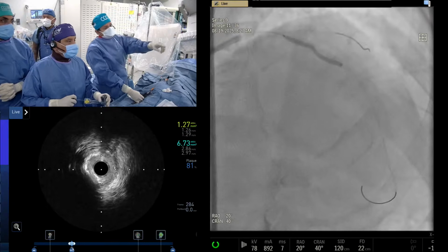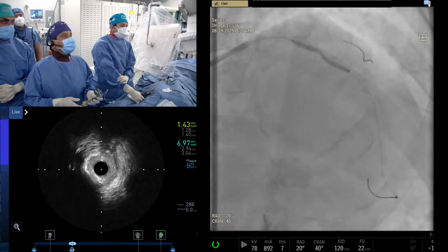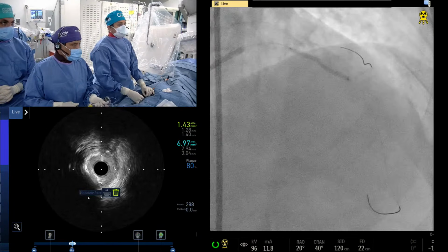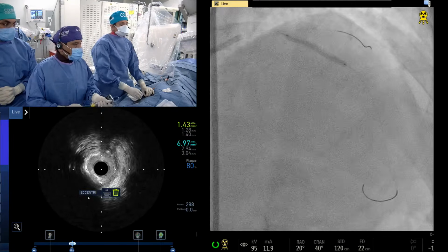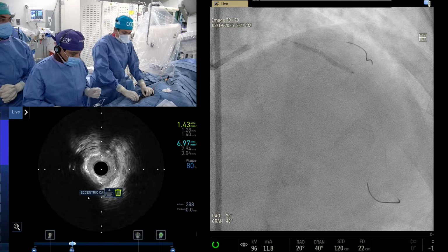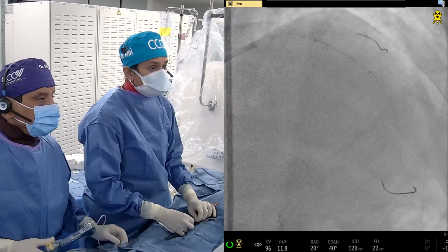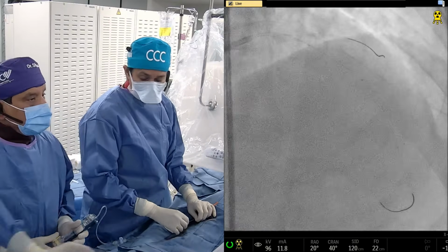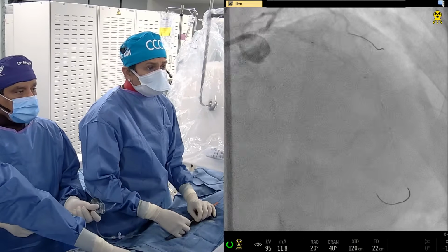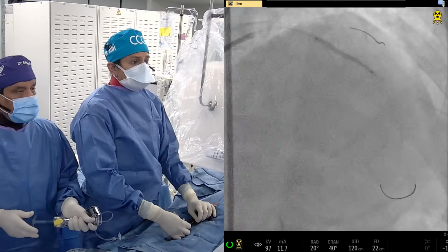It's now at 14 atmospheres. The level of the plaque was the issue for the IVUS to make a turn. Fluoro, see the significant plaque open up at 14 atmospheres. Nicely opened. That's where we are placing the stent, for the future disease of the LIMA. Give me some dye. Good, that's good. Go. Okay, 12 atmospheres.